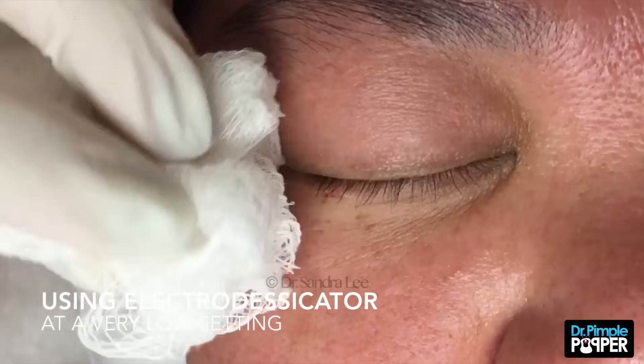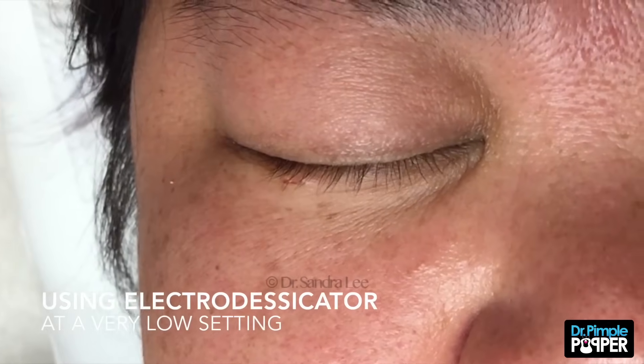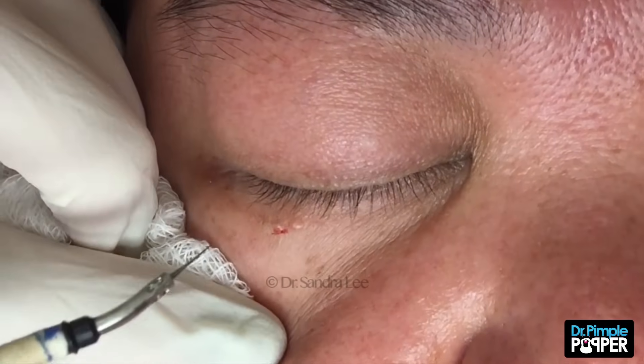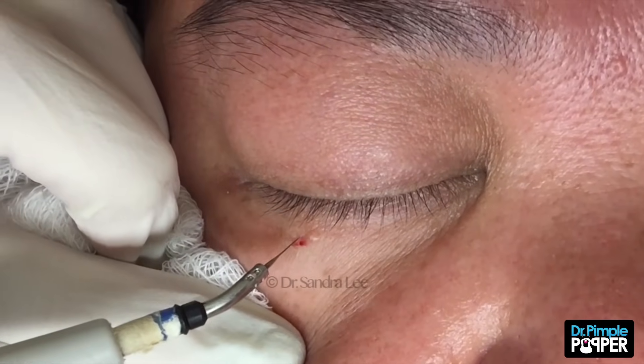You should be numb here. You're gonna hear that buzzing noise — I'll let you know when I'm doing something. I'm just gonna pull you down here, you might just hear this knob noise here, okay?